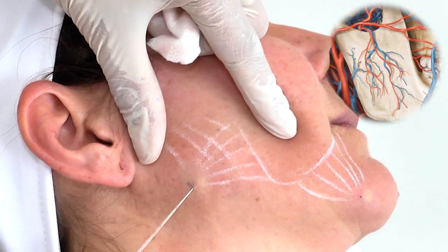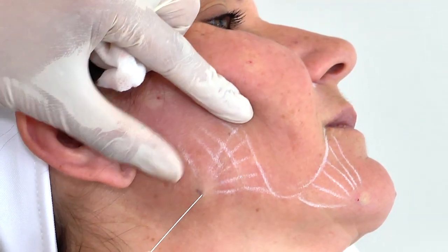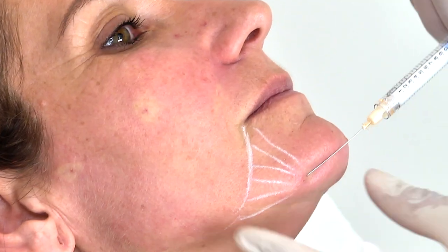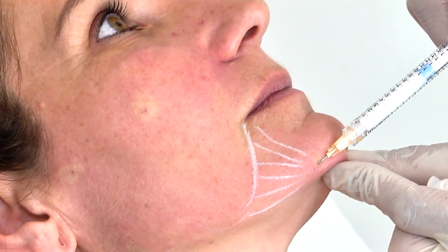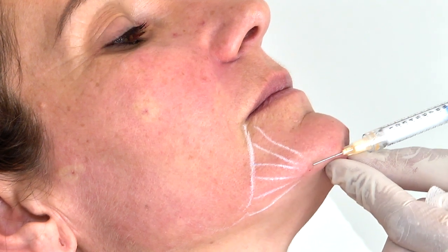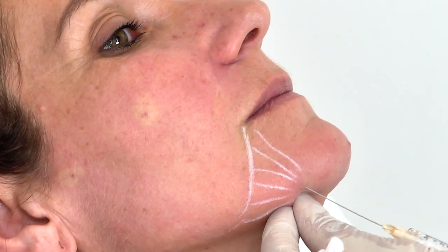Make the retrotracing injection in the inferior face of the mandibular bone by removing the syringe to obtain a linear and homogeneous Radiesse deposit. Again, opposite the inferior face of the mandibular bone and without removing the end of the cannula from the skin, change its direction and inject as many new lines as needed. Going up along the lateral face of the mandibular angle, the adjacent product lines are fanned out while limiting the number of injection points.